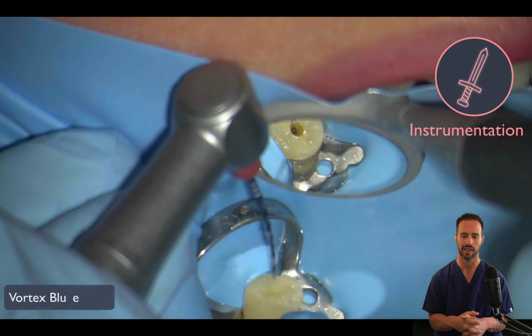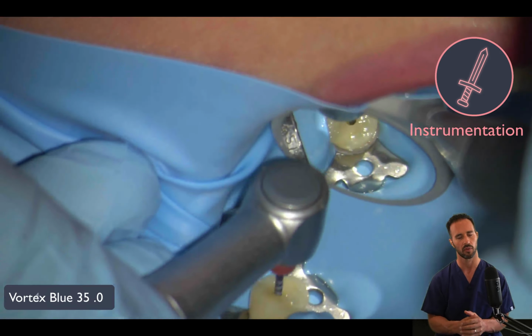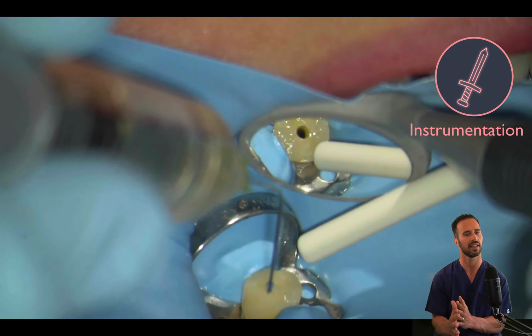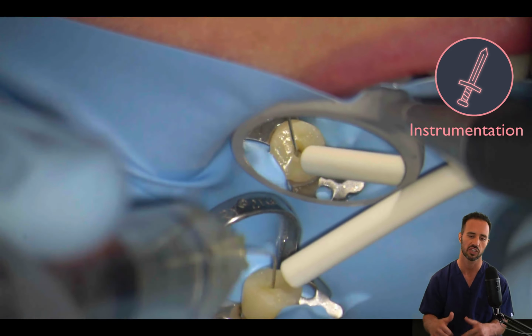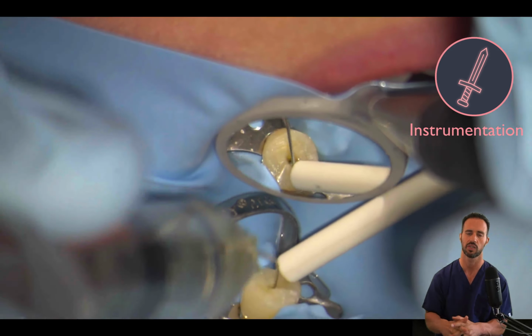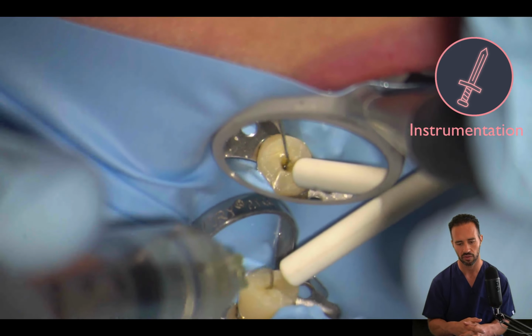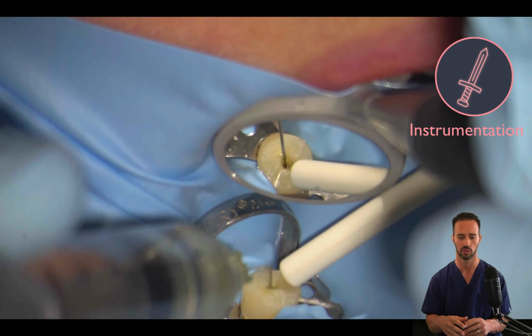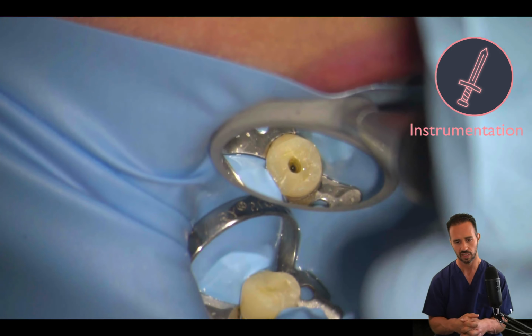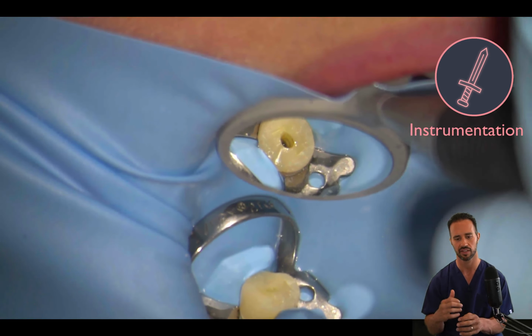Okay? And now we got our size 35 Vortex Blue 04 taper rotary file. That's very, very good. And you know, you can see it's starting to look like a final shape internally. You'll notice that the walls look nice and clean as we get into our bigger rotary files. So lots and lots of sodium hypochlorite here. That's going to, like I said, make all the difference in your disinfection. And like I said, you can see that it's nice and clean in there. It's starting to take its final shape.